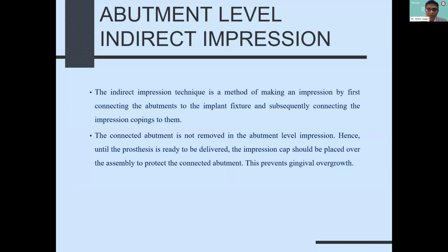The connected abutment is not removed in the abutment level impression. Hence, until the prosthesis is ready to be delivered, the impression cap should be placed over the assembly to protect the connected abutment. Now, this is where you have a straightforward case.